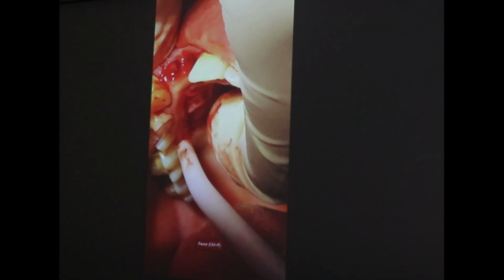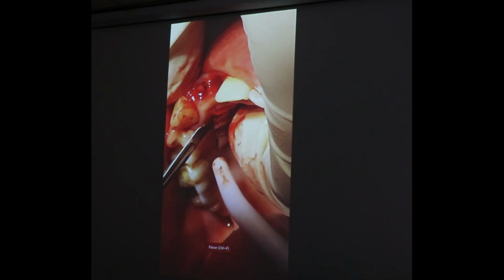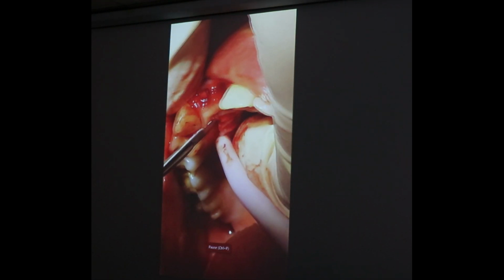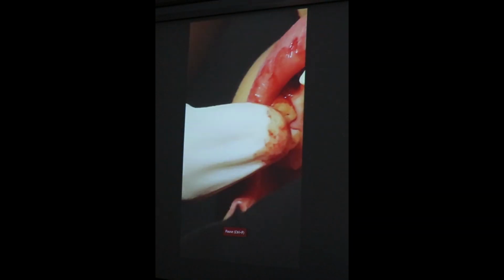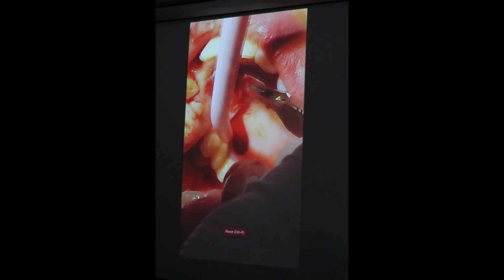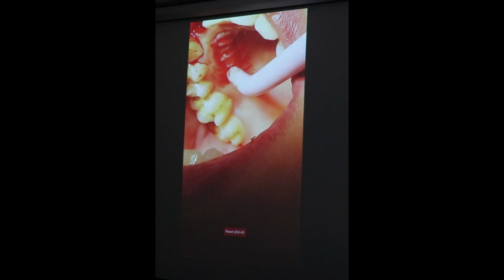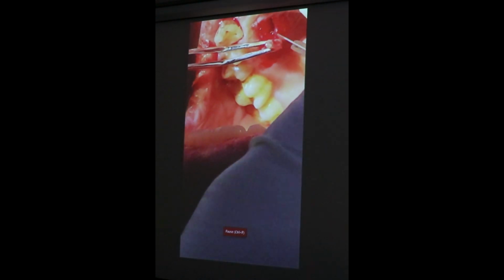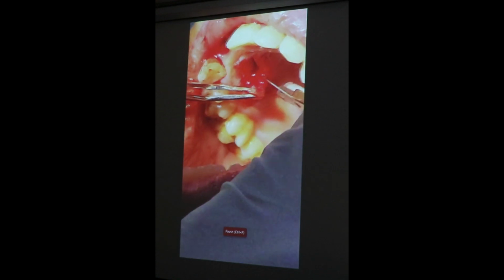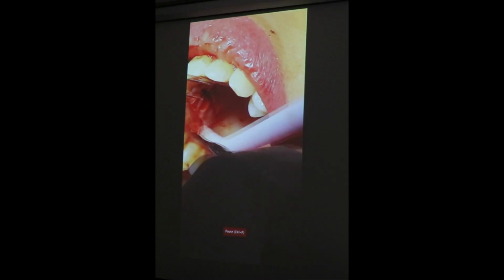So did we do the cuff height? We did. But did we do that straight part in this case? So we missed one of the 7 points. Yes, probably in this area where I was placing the crown, I could also have stayed more away from the gingiva. That could also be one contributing factor that the gum went slightly higher.